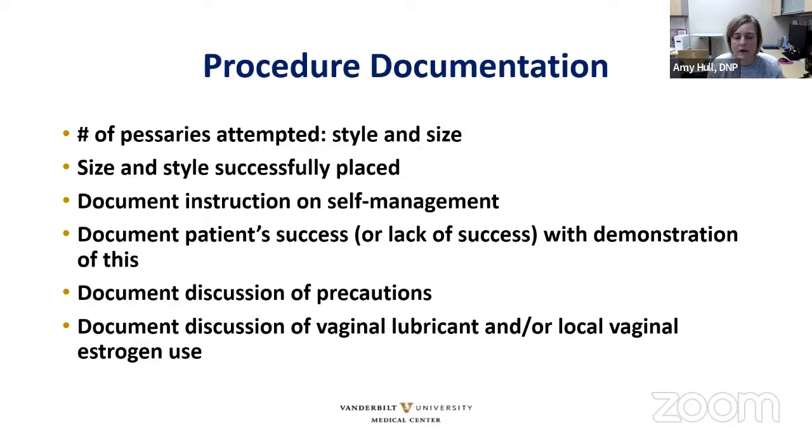It's not a bad thing to use. It does help with the vaginal integrity. It can help with the microbiome of the vagina. Certainly what information we do have, estrogen can be quite helpful once an erosion or once a complication does occur. We don't really know if it's a sure bet that it's going to prevent problems, but we do have pretty good information that it can help improve problems once they've occurred.